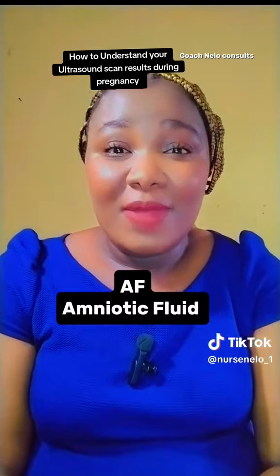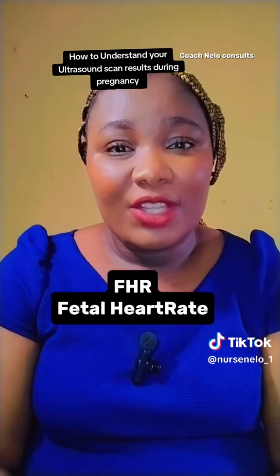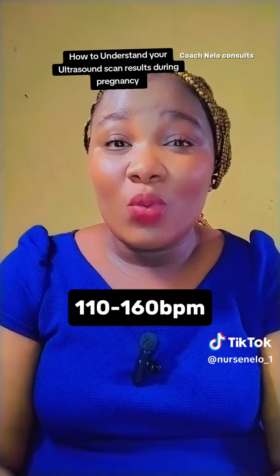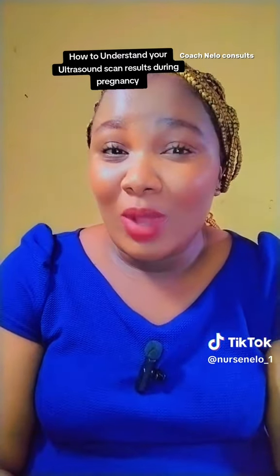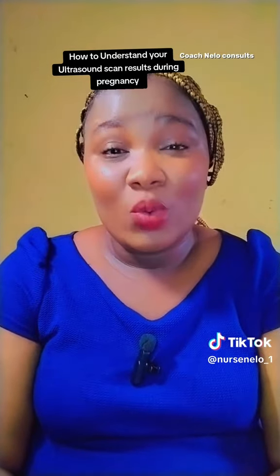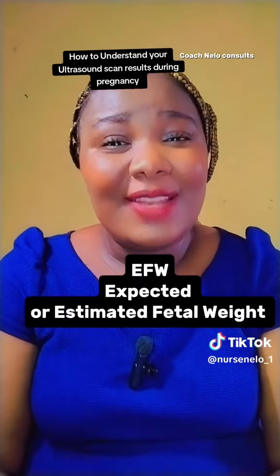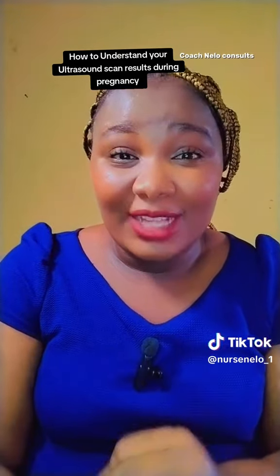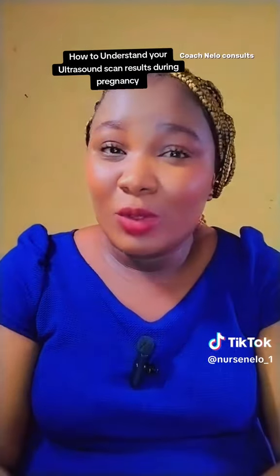Then AF means amniotic fluid. So in the result, it might be adequate or inadequate. FHR means fetal heart rate, usually between 110 to 160 beats per minute. In my last video, I mentioned 130 to 160, but 110 to 160 is also okay. Then EFW means expected fetal weight. That is depending on the age of the pregnancy at the time of that ultrasound. The expected fetal weight at that time will also be mentioned.